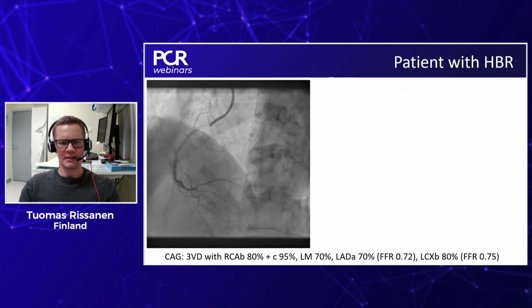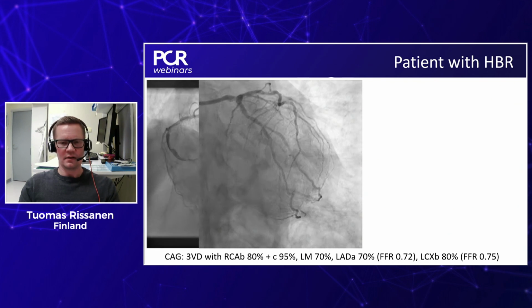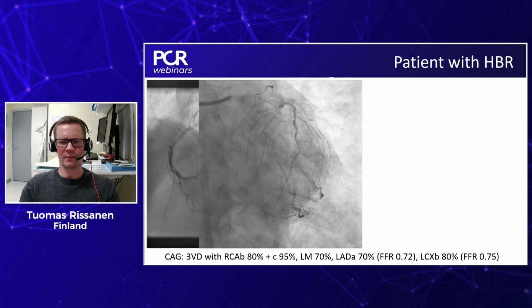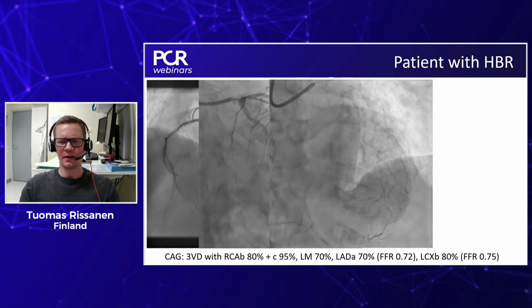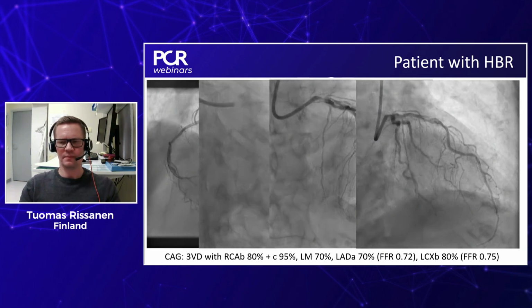Here you can see the right coronary artery. There is a very tight lesion just before the crux, and then 2 eccentric lesions in the middle RCA. And I would say that there is also reduced flow in the distal vessel. Here you can see the left system. There is a stenosis of the distal left main, and also in the mid-circumflex, just after the ostially diseased marginal vessel, there is a hemodynamically significant eccentric lesion. And then in the LAD, there is also a significant lesion as studied with FFR. And here is another view on the proximal LAD.